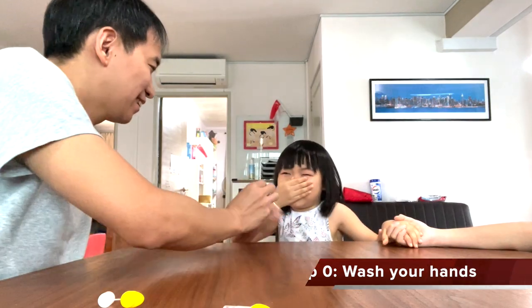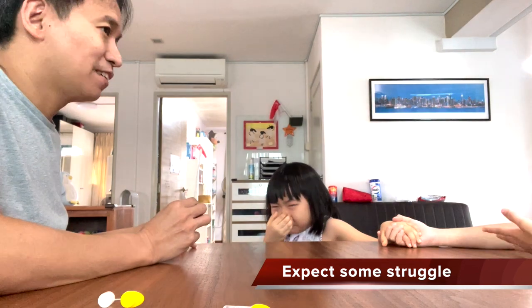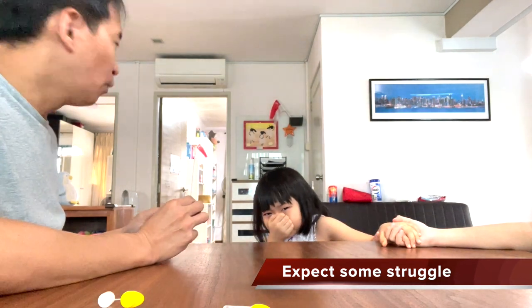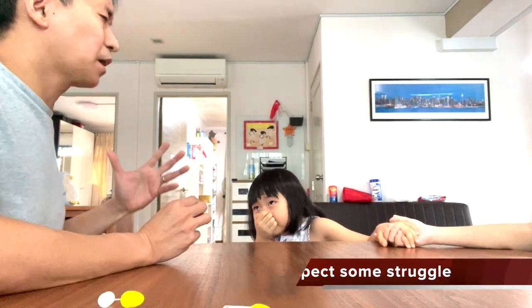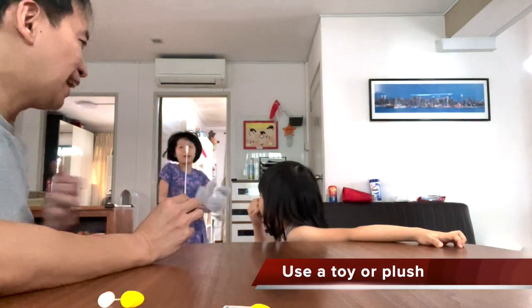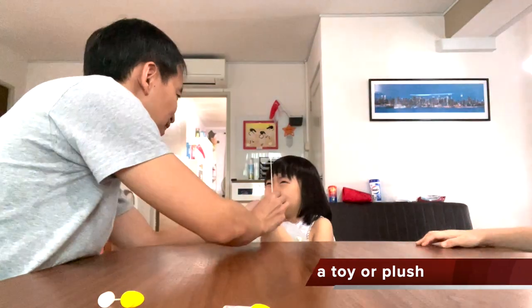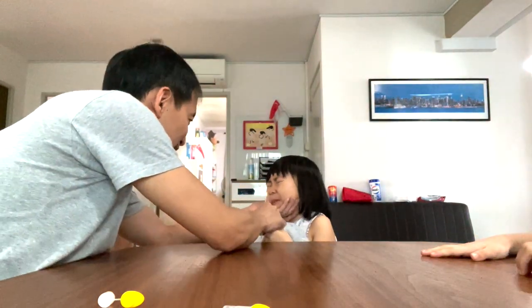You can squeeze my hand. She's a scaredy cat — I know. We can give her a stuffed toy so that she can squeeze it. Both hands will hug Bunny, two hands hug Bunny. And the nose — we start with this nose. Okay? Don't cry.